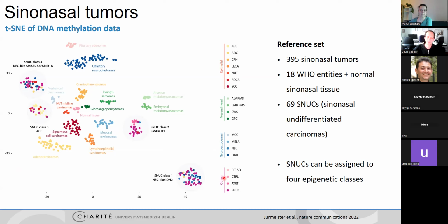That is something that we are working on, and there could be certain entities where this actually improves the classification power, or where we may even see that if we do this deconvolution, we are able to identify further types of tumor classes. But it is technically not that simple to generate a DNA methylation-based classifier that has a prior step of deconvolution. At least we were not able to do this in a clean way so far. Okay, I hope that answers the question.